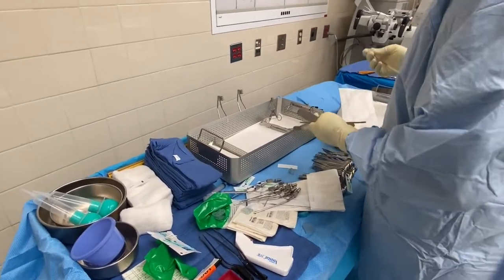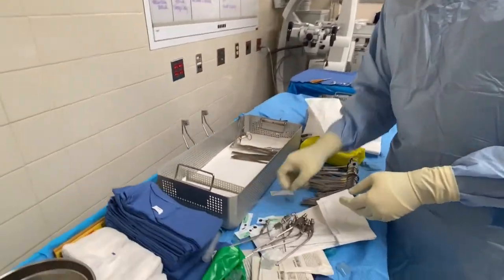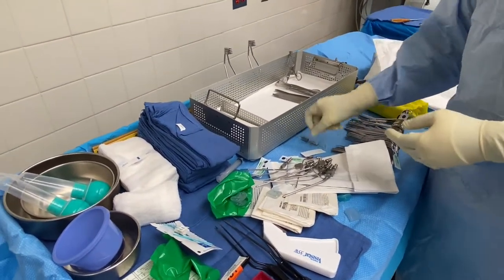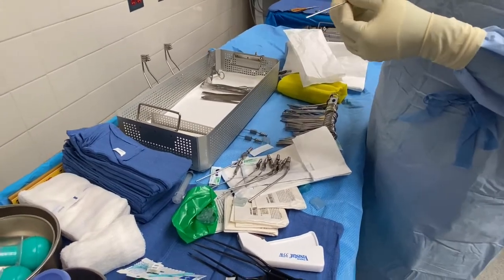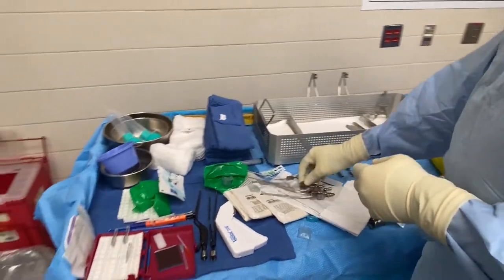This is called ribbon — malleable retractors. Put one of them in the middle, then put the rest right here. For your suctions, never get rid of them — always arrange them in size order so if the doctor asks for a smaller version you already know what to grab.